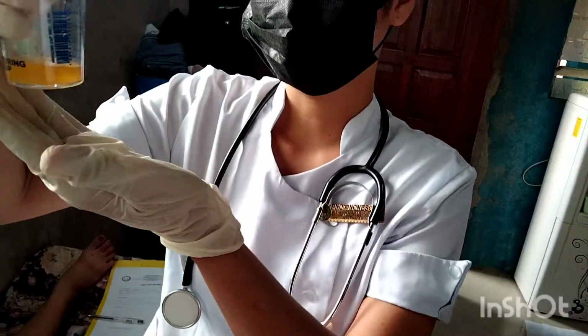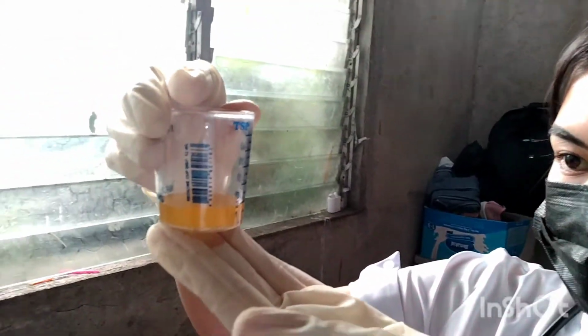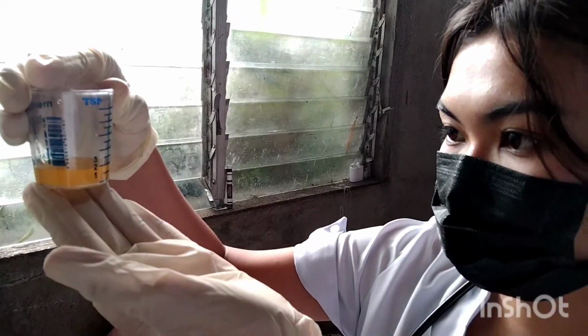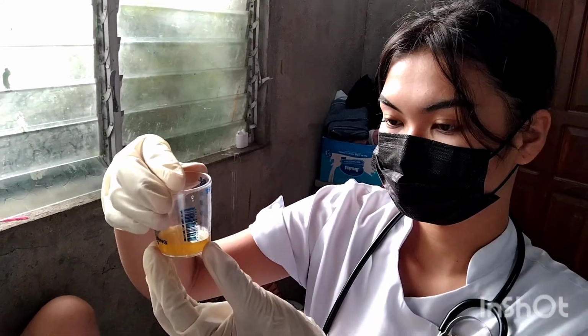Next, observe the aspirate's appearance. Gastric fluid is usually cloudy and grassy green or tan or off-white in color. In contrast, intestinal fluid is usually deep golden yellow and is clearer than gastric contents.